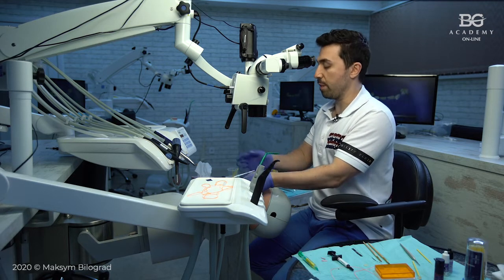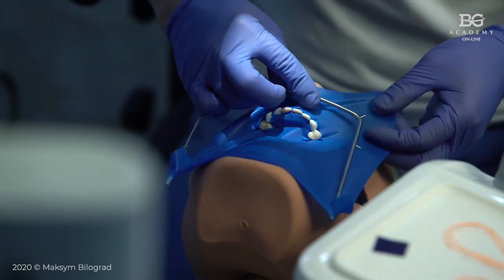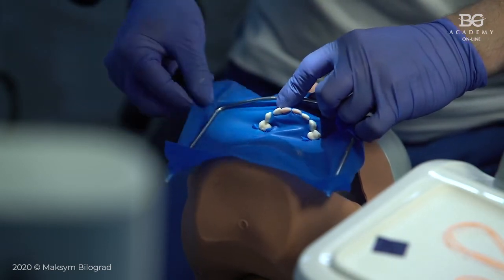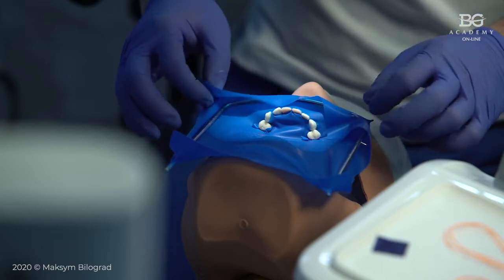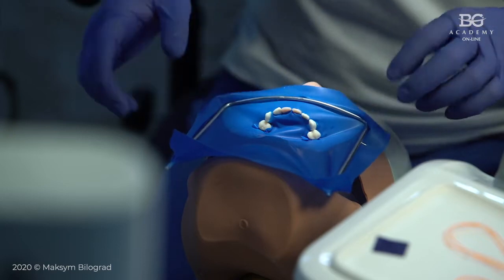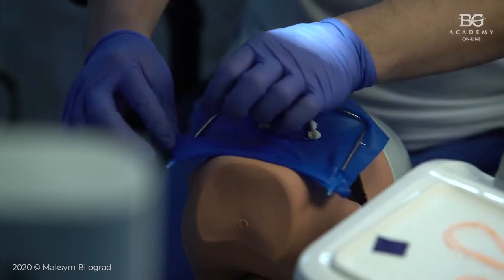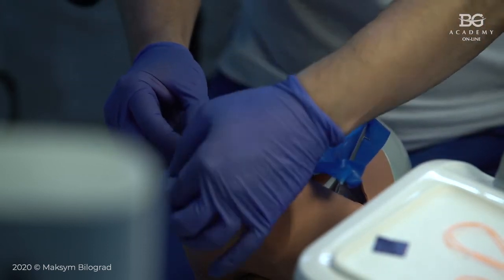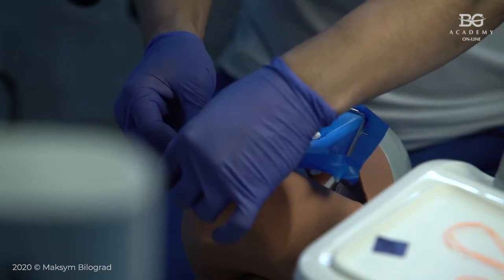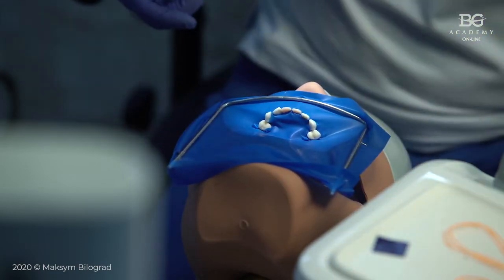So we put the rubber dam over the frame. Okay, we move from the top, put this rubber dam on the frame. So there is no problem with the patient's nose. You see, this is the nose, this is the bar, the patient can breathe, everybody is happy. So don't be afraid to use rubber dam in this specific way. This specific way will help you later on to get a really good inversion of the rubber dam with floss.